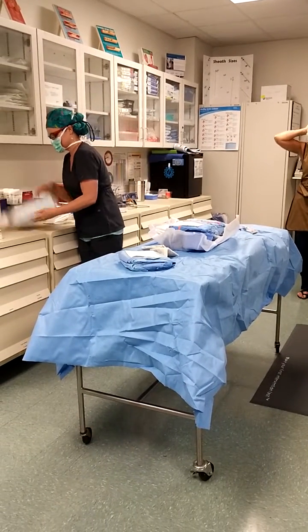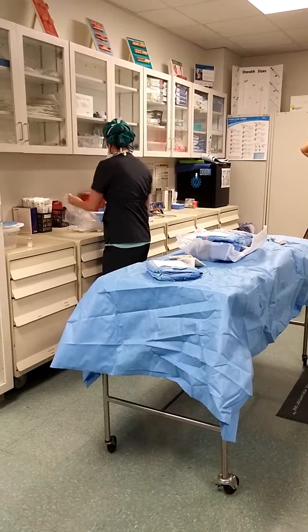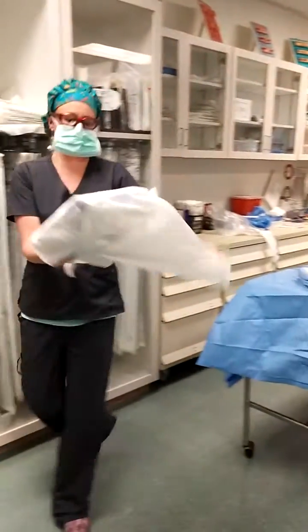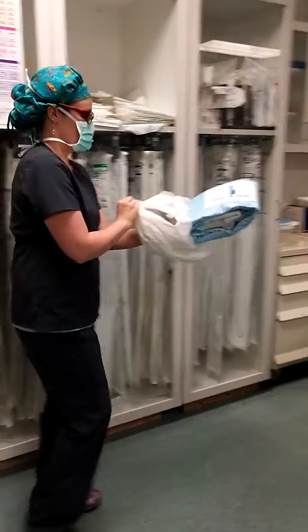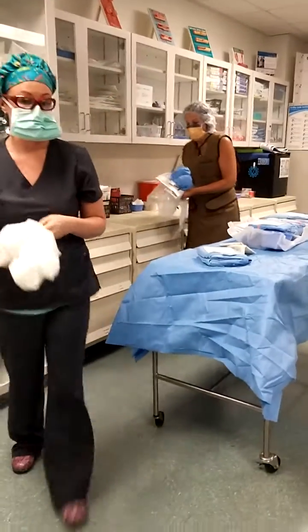The radial. Notice how when I open stuff, I step away from my table, right, so that it's all covered, okay. Alright, I'm going to go scrub.